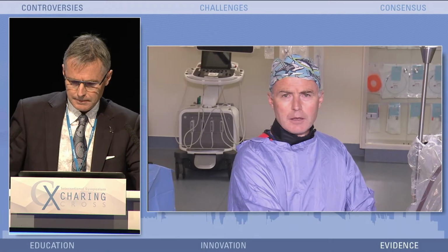So let's switch to the right side, and some of this again is pre-recorded. Today we're underway with the right leg intervention. By the way, he's done very well clinically on the left side and reports that his left foot is warmer than he can remember for a long time, which is very pleasing.